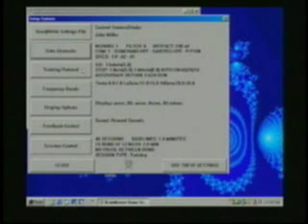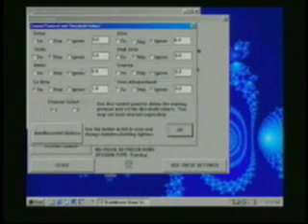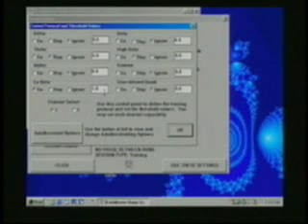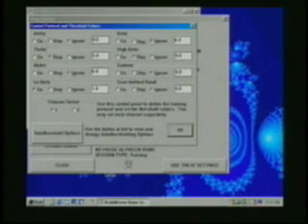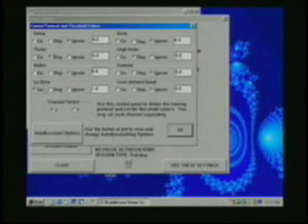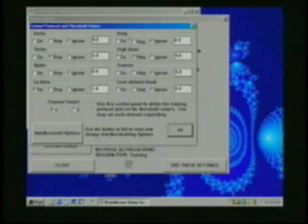Next we'll review the training protocol. This screen allows us to select the training protocol for each of the 8 frequency bands. Delta, theta, alpha, low beta, beta, high beta, gamma and the user defined band.